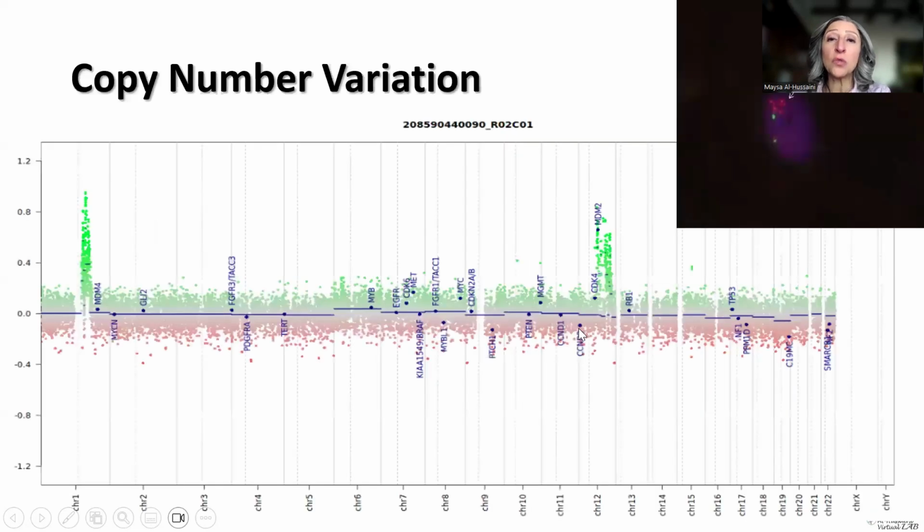However, what was really very helpful in supporting the diagnosis, especially that the differential diagnosis would be a lipoma, only a lipoma with no evidence of malignant features or no evidence of liposarcoma. This was the main differential diagnosis.